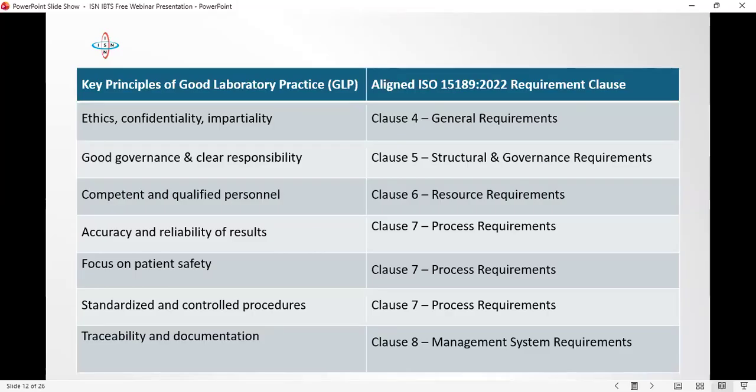The doctor will request an investigation. You need to gather information, clinical picture, age, sex, because some of these have an impact on the quality of results that you produce. Remember the 8 millimoles per liter result that you're getting for a diabetic patient who has been managed over the years, and it has become the person's normal result.